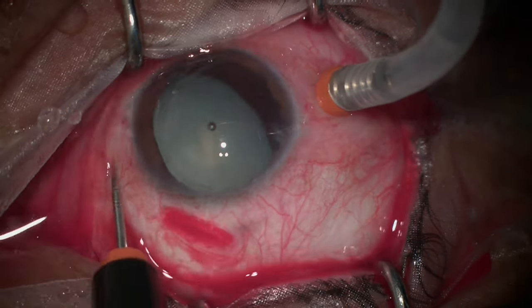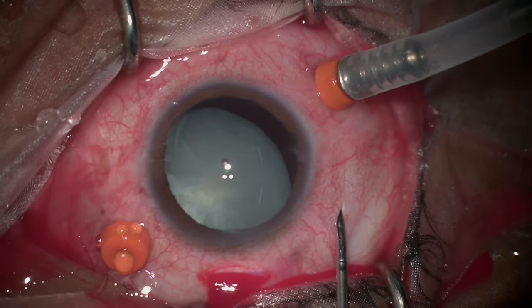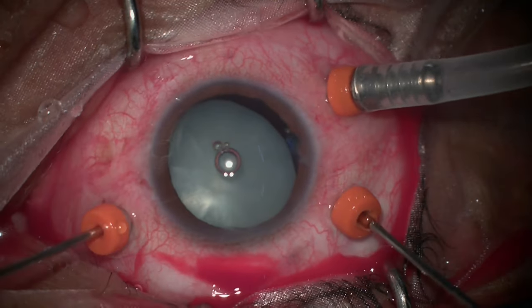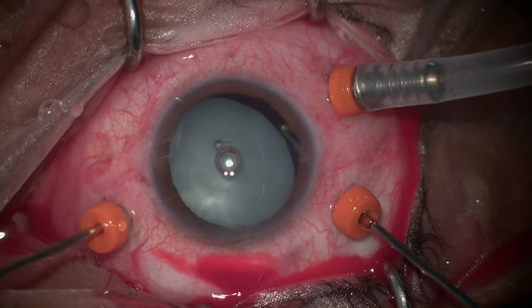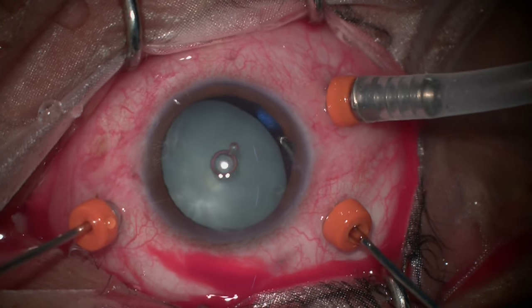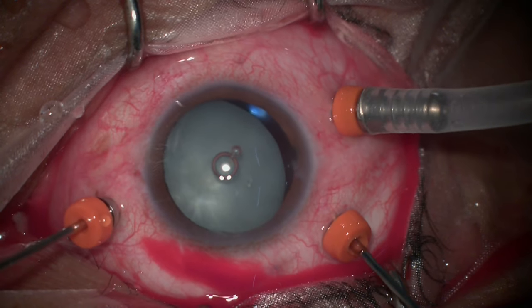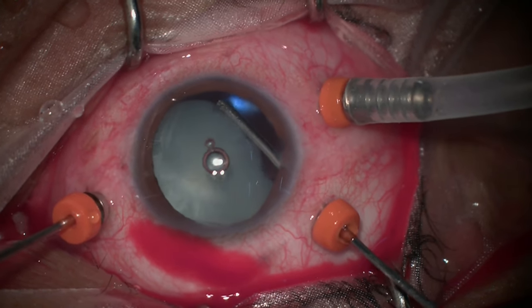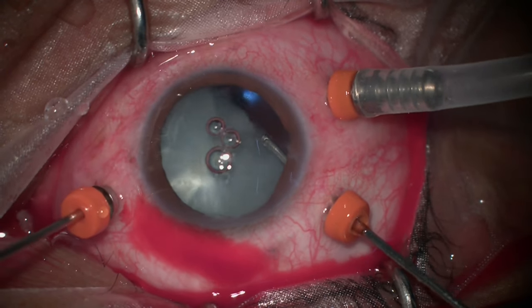In the OPD it was apparent that the capsule was probably just destabilized, but on the OT table it was clear that the lens was not in place. It was not possible to manage it by retaining the capsule and putting in a PCIOL in the bag, so a lensectomy using a vitrectomy cutter was planned.